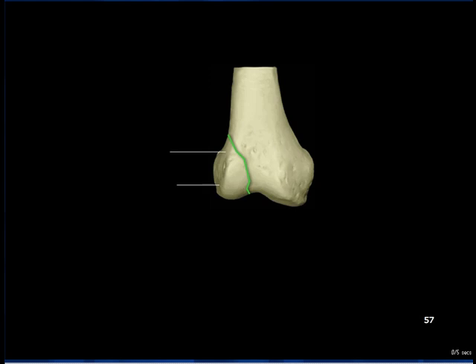The fracture is first reduced and held provisionally with one or more Kirschner wires. A 3.2 mm pilot hole is then drilled across the fracture plane and its depth measured. A 6.5 cancellous tap is used only to open the thin metaphyseal cortex and the immediately underlying cancellous bone. The screw of chosen overall length and thread length is then inserted. If the cortex is anything other than strong, then a washer is used. If in doubt, use a washer.